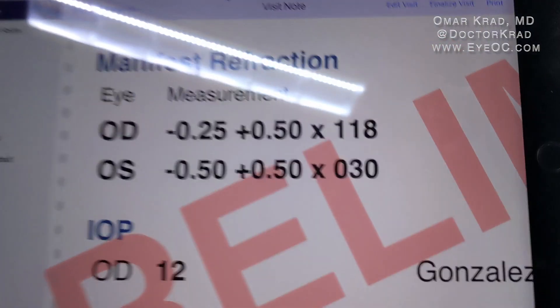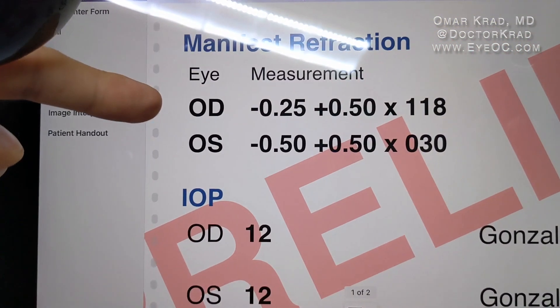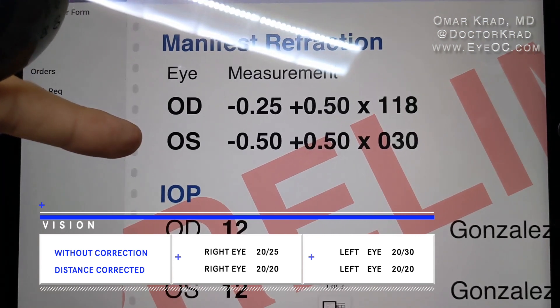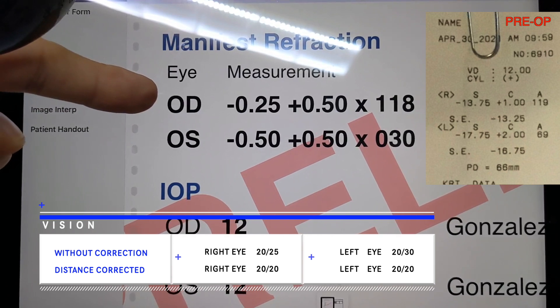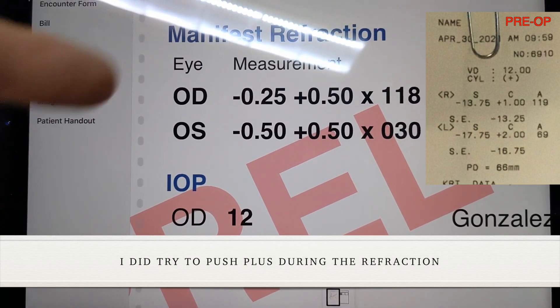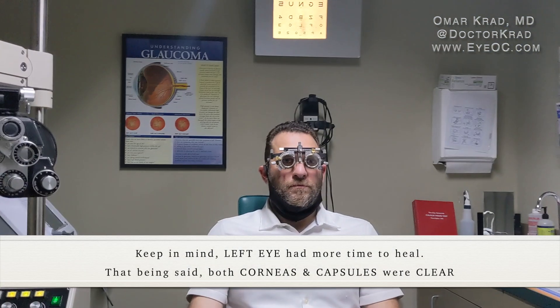Today we have a patient with a PanOptix lens in one eye and the new Synergy lens in the other eye. We're going to compare the subjective vision in both eyes. This is his current manifest refraction — here for the Synergy and here for the PanOptix. Prior to surgery he was a high myope of minus 13 in the right eye and about minus 17 in the left eye. He's been distance corrected with trial lenses, and all lenses have been cleaned for a fair comparison.